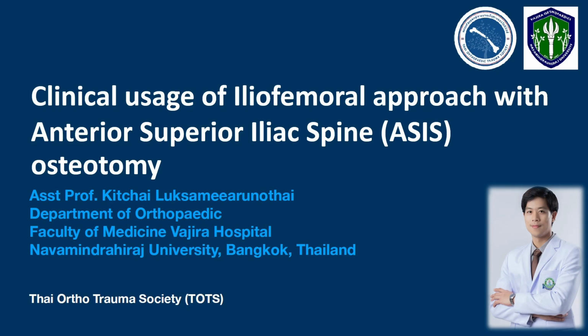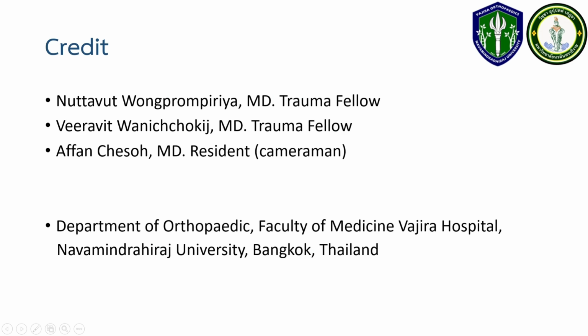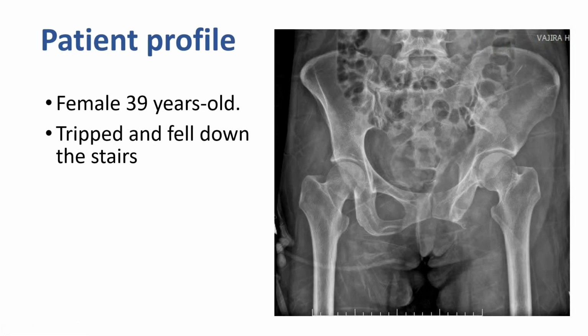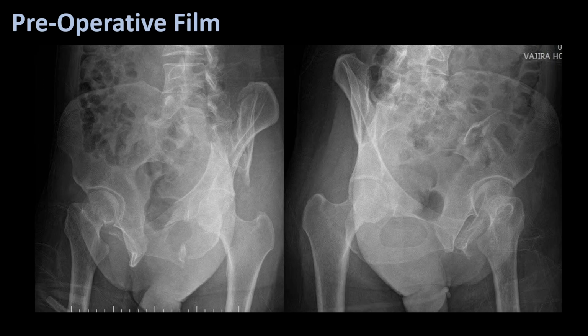Clinical usage of iliofemoral approach with ASIS osteotomy. Case example. A 39-year-old female patient suffered from falling down the stairs. The X-rays show a fracture of lateral compression type injury of the left hemipelvis.